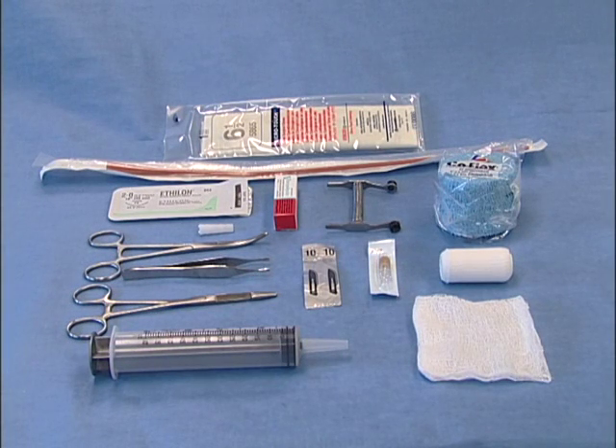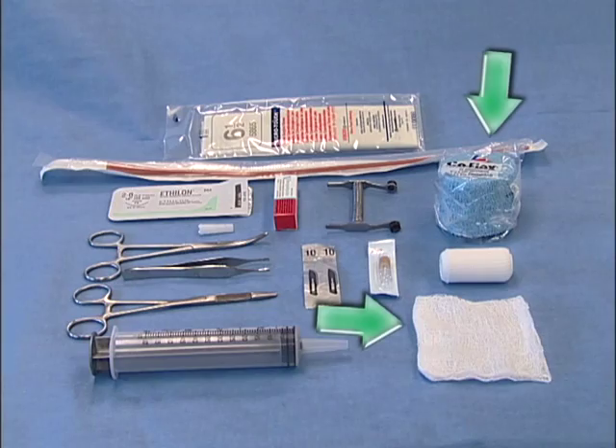For placement of an esophagostomy tube, you'll need gloves, a red rubber feeding tube, suture material and instruments, a carmalt or curved haemostat, a scalpel blade, Christmas tree adapter, injection cap, mouth gag, a catheter adapted syringe, and bandaging material.